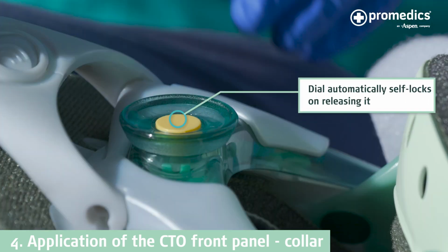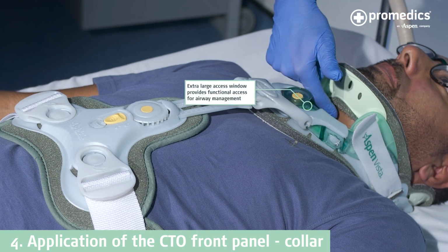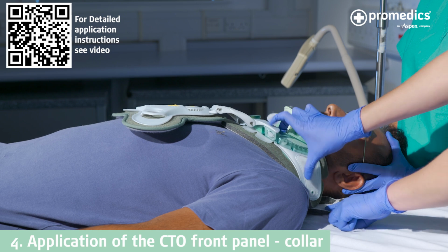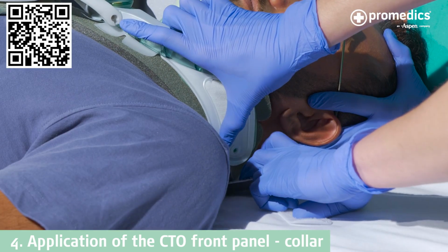To ensure the dial is locked, twist the dial without pulling to ensure it is in the locked position. Check the patient can breathe and swallow. The collar should be tightened by tucking the side panel around the neck and pulling the Velcro tabs forwards. Repeat on both sides.